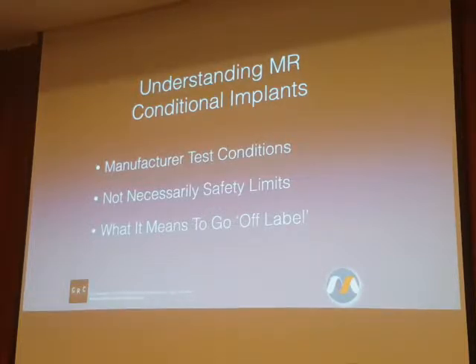Or maybe I have a friend who has an old, 0.3 low field, permanent magnet system, and he'll test it for me for free, and so I can collect the data on a 0.3 system. It doesn't matter that most patients who would get this implant are probably going to need to be imaged at 1.5 and maybe 3. I'm not obligated to test it under systems that the patients are most likely to need exams on. I can test it on whatever system I want.